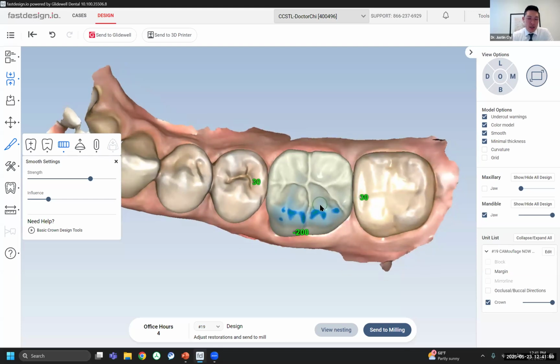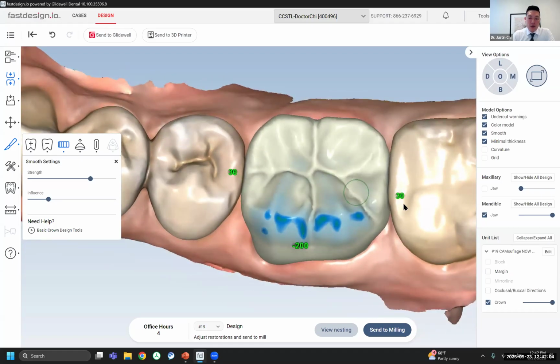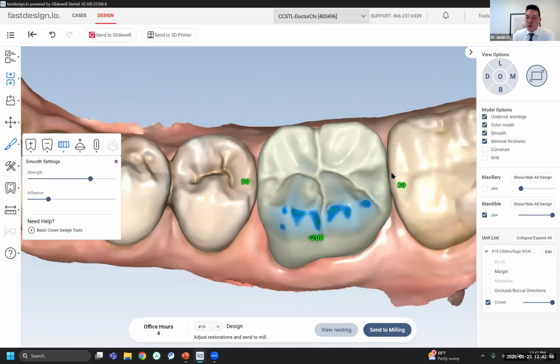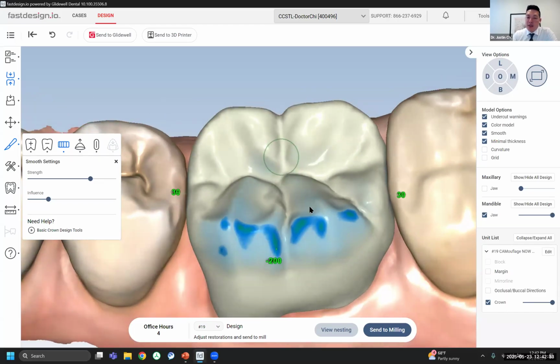So that's pretty good. In normal occlusion, and again, we're talking about endo-treated teeth, most restorations, but especially with endo-treated teeth, we want the contacts to be concentrated in normal occlusion on the buccal zone and maybe in the central fossa too, because when the patient bites, the forces are directed more downward, in more compressive forces. We want to limit the amount of lateral forces in most cases. So if I saw contacts on these inclines here, I might want to lower those down.